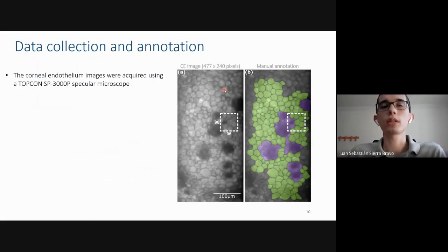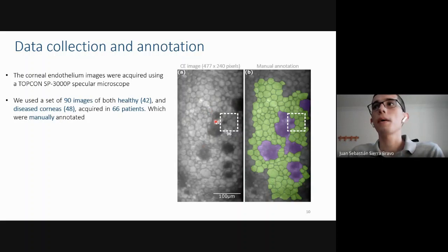The cornea endothelium images used in this research were acquired using a Topcon SP 3000P specular microscope. A manual process was made to annotate each image to segment manually the cells and the gutta. In this example, the green color corresponds to cells and the violet color corresponds to diseased regions. In this research we used a set of 90 images of both healthy and diseased corneas acquired in 66 patients, which were manually annotated.